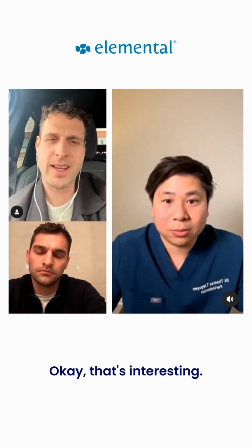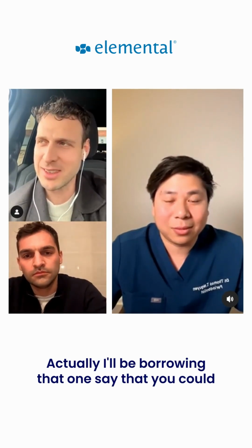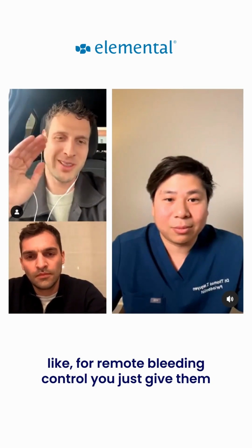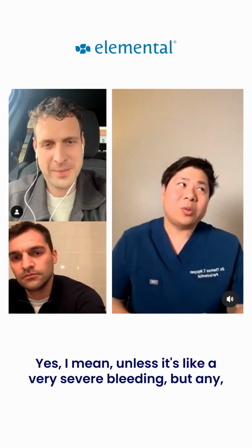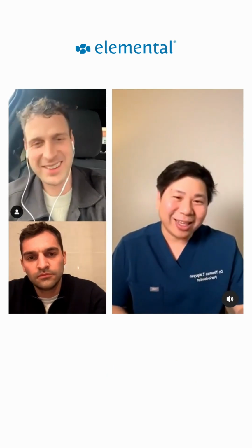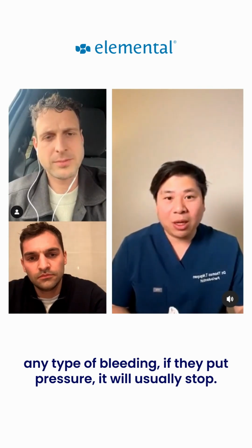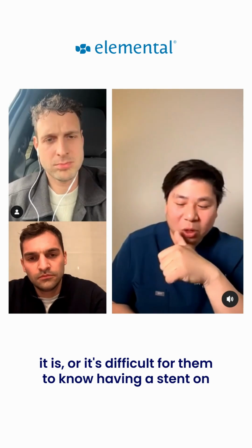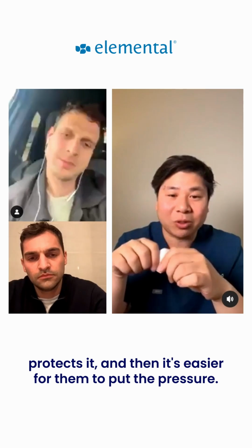Okay, that's interesting. That's a new anecdote for me, actually. I'll be borrowing that one. You could use it almost as a remote bleeding control. You just give them an extra tool that they can apply themselves. Yes, I mean, unless it's a very severe bleeding, but any type of bleeding, if they put pressure, it will usually stop. If you don't want them to put pressure directly on where it is, or it's difficult for them to know, having a stent on protects it, and then it's easier for them to put the pressure.